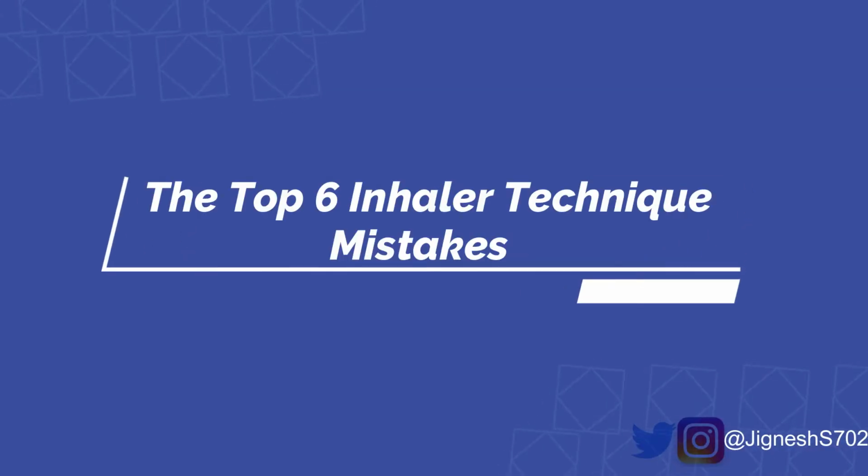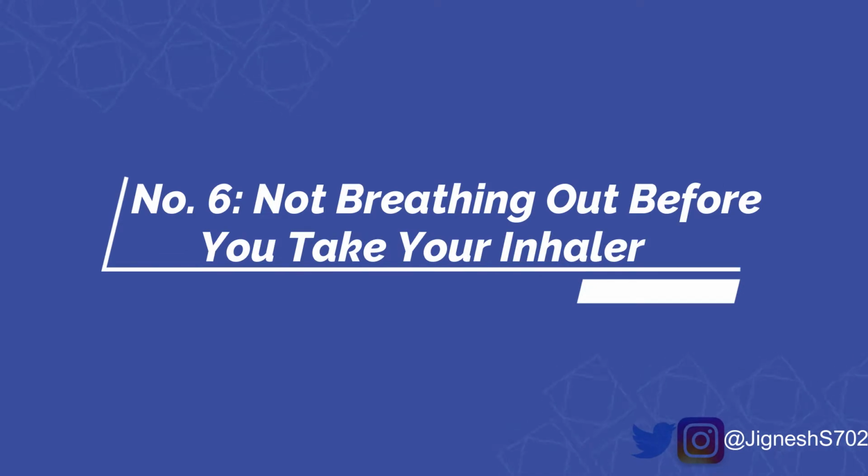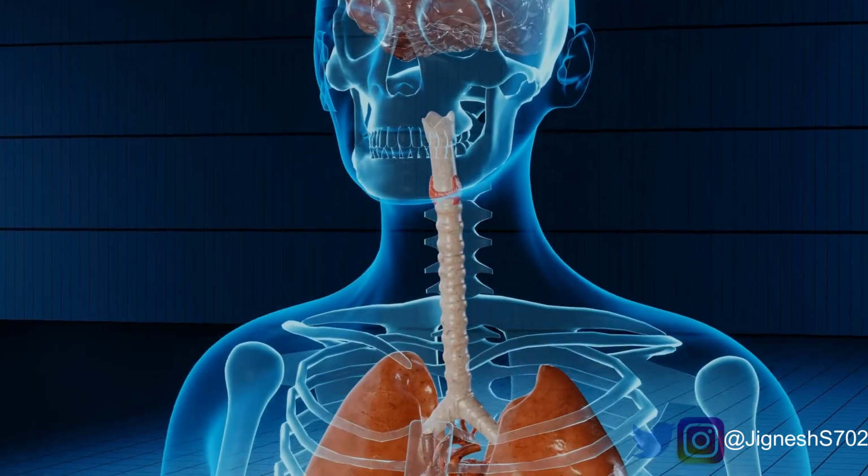So, in no particular order, here are the top 6 inhaler technique mistakes. At number 6, we have not breathing out before you take your inhaler. Now, when you breathe out as fully as you can before you take your inhaler, you make space in your lungs for the next breath in. This allows you to take a deep and long breath in when you inhale your medicine, giving the medicine a chance to reach far inside your lungs. If you don't breathe out before you take your inhaler, it becomes a lot harder to take a deep, long breath in, and in theory, a lot harder for the medicine to penetrate deep into your airways.